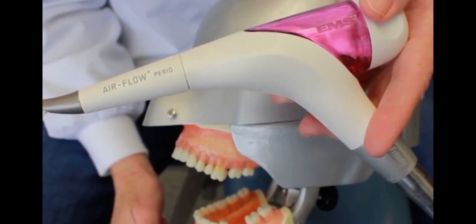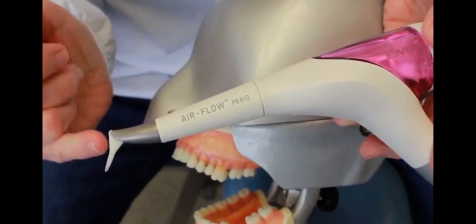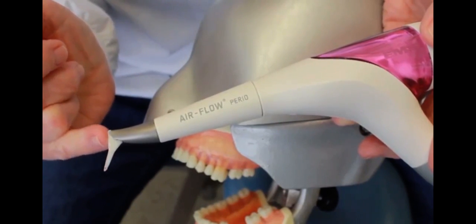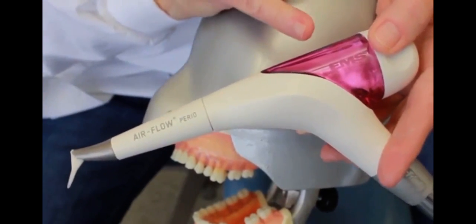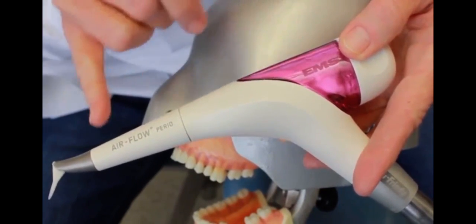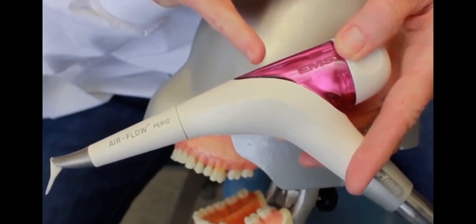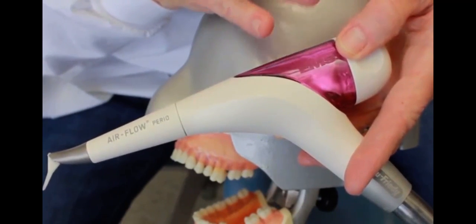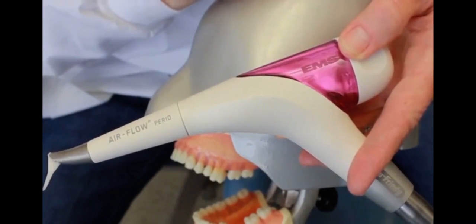We use a flexible plastic tip that is 10 millimeters in length, and the glycine powder is put into the air flow. This happens to be the Air-Flow Perio. Hu-Friedy manufactures this, and it's a very good piece of equipment. I'm going to go in the mouth and show you how to use this.